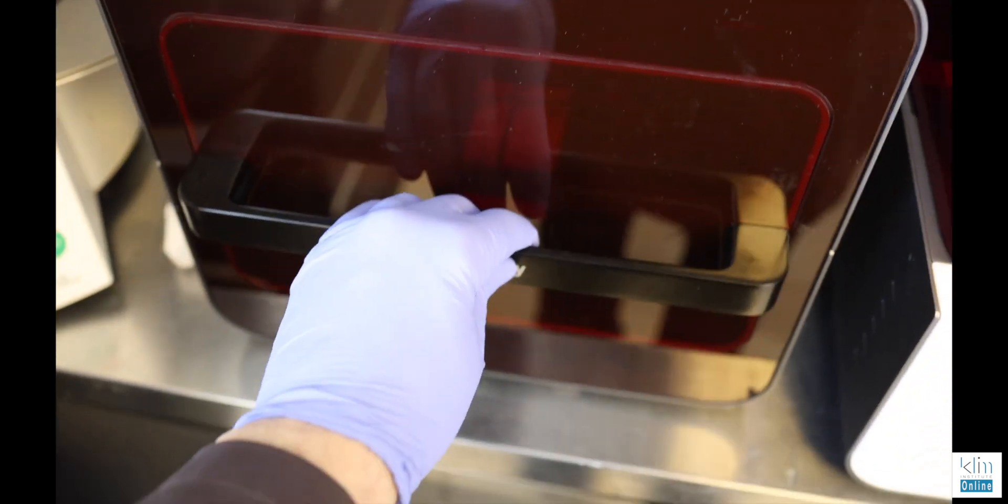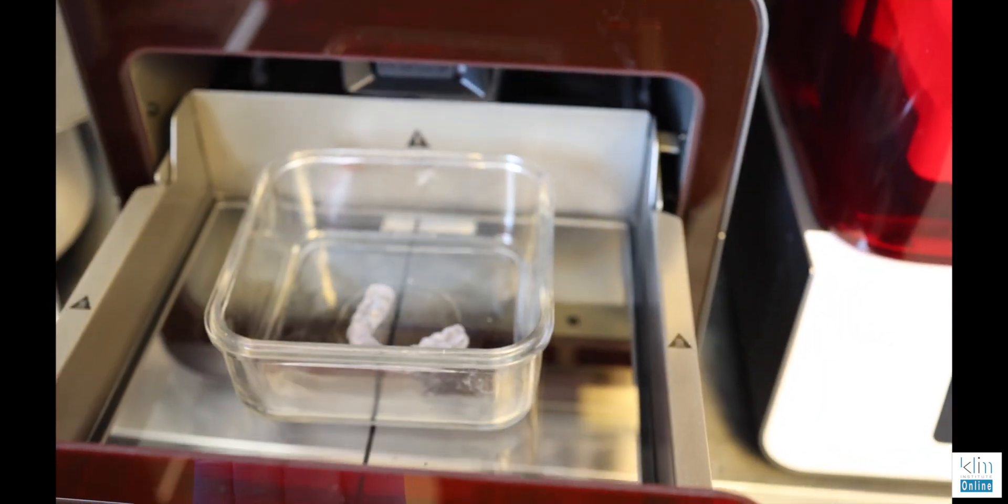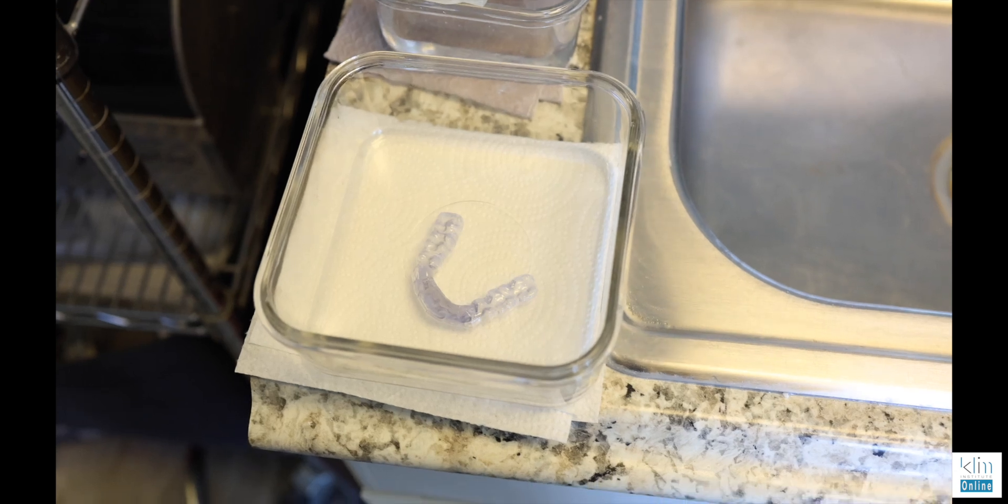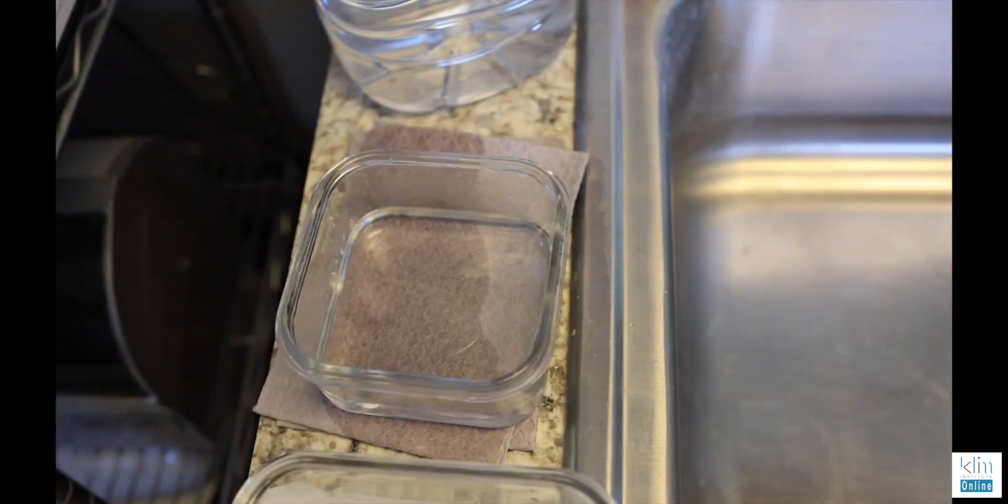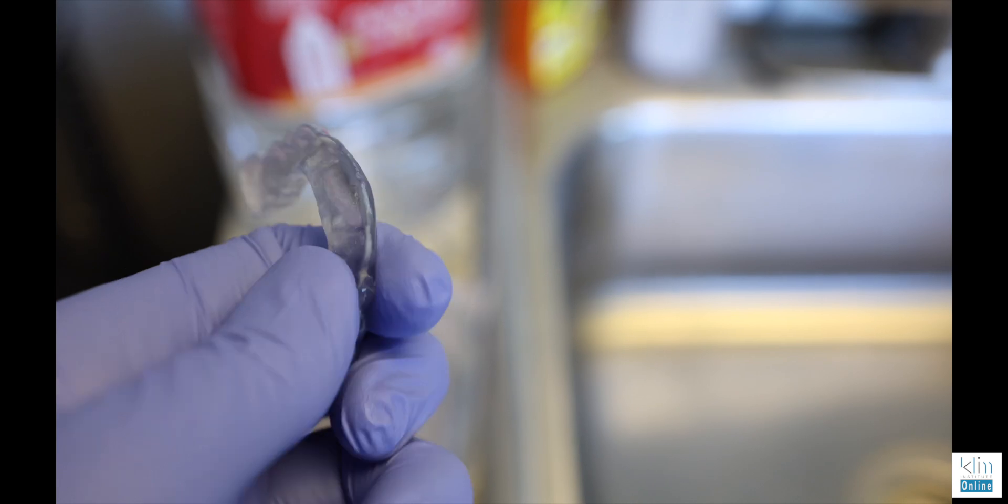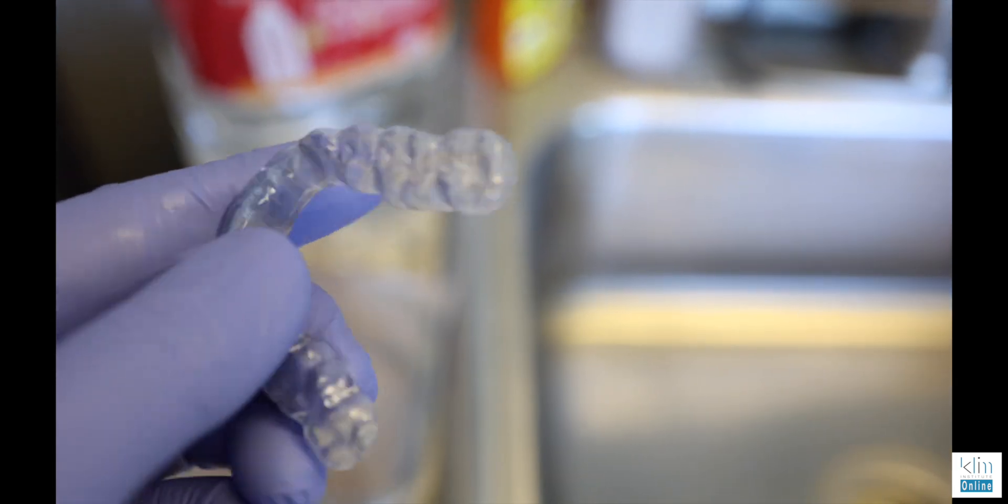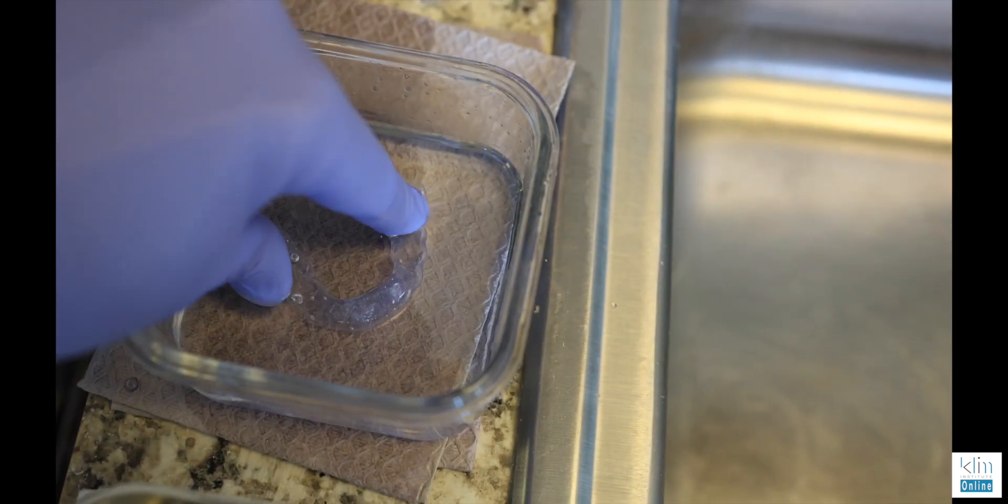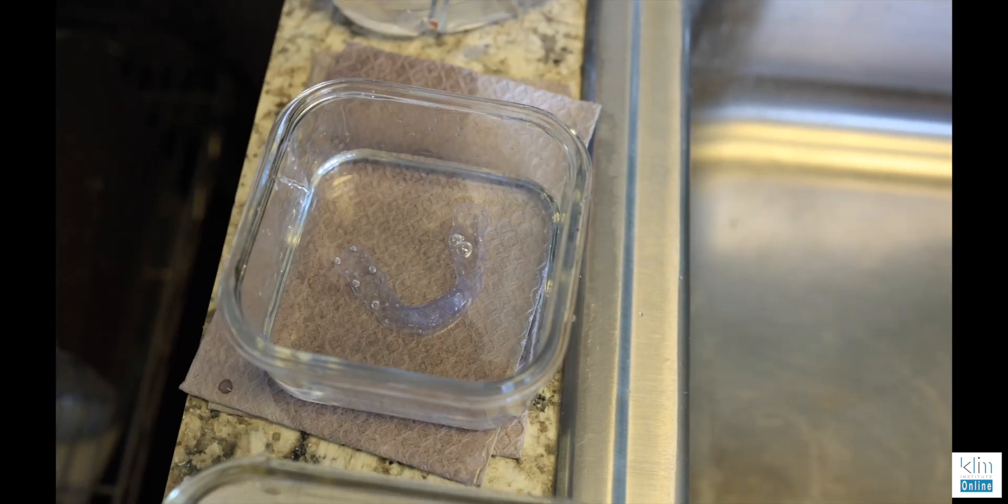Following the first cure, we're going to take that appliance and transfer it over to another ceramic container with glycerin in it and do a second cure. What the second cure is for in the glycerin is to remove the oxygen inhibited layer, and this appliance will result with a high gloss finish without any polishing.